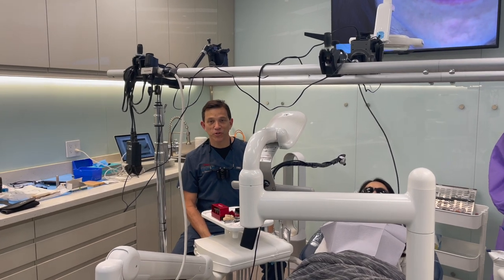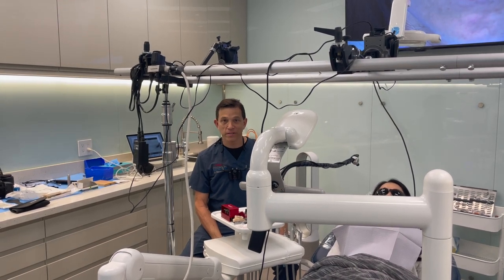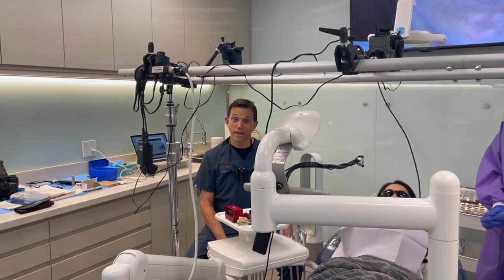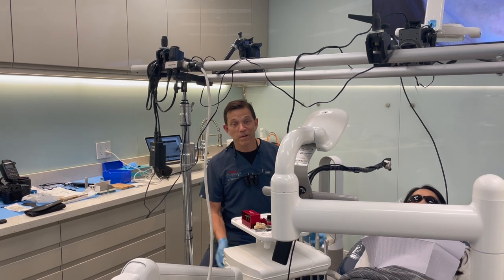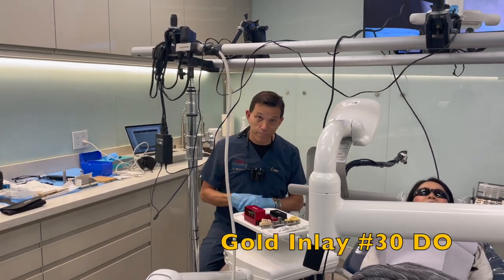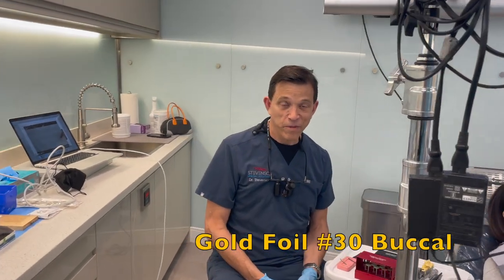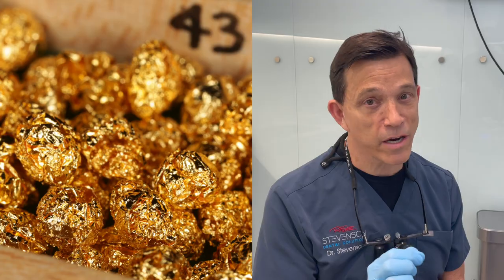Hey everybody, I'm Dr. Richard Stevenson and you're looking at our operatory here in San Dimas, California, where we have set up to make a few videos. Today we are going to perform a cementation of a gold inlay, finishing and polishing. I'm also going to perform a gold foil procedure on the buccal of tooth number 30, and after I prepare it in its appropriate shape, we'll show you how we take incremental pieces of gold and cold weld them together.